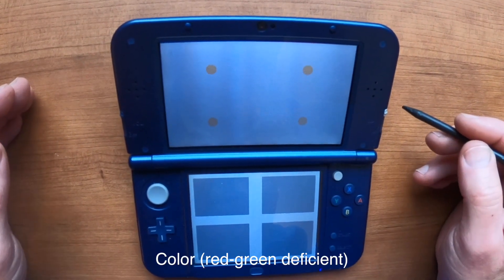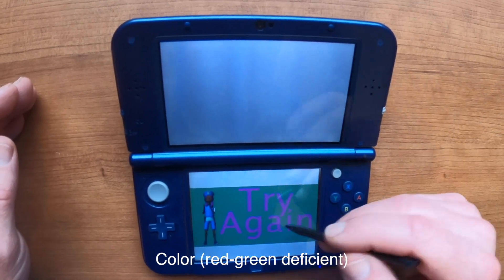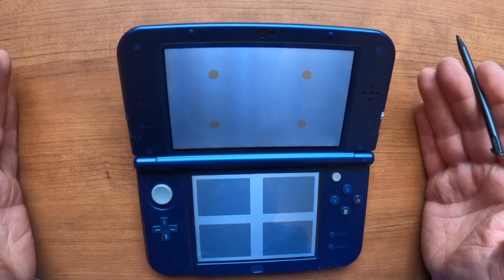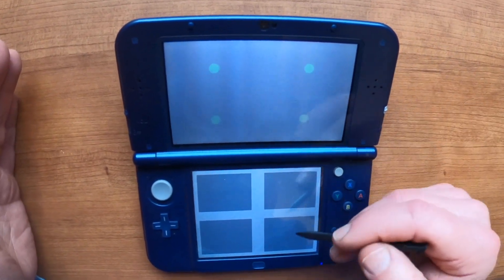Color vision. Wait and see if you can tell one that's different. If we check wrong, it allows us to try again. Wait carefully till you see one that's different. Again, look for one that's different.